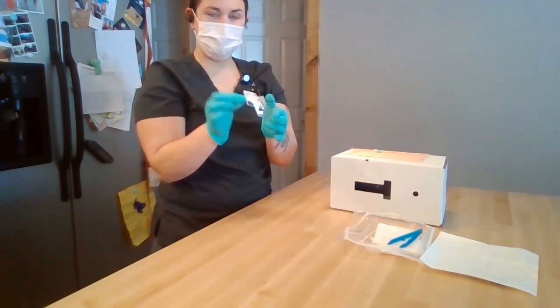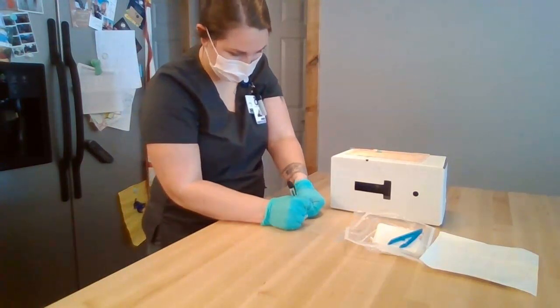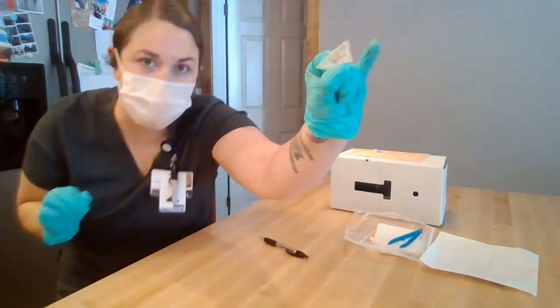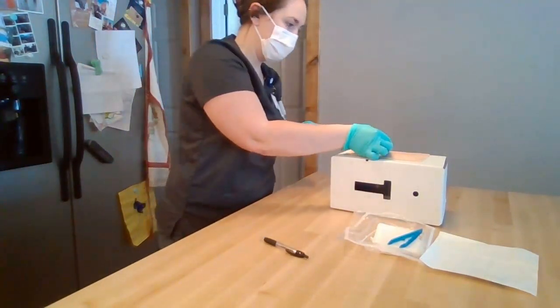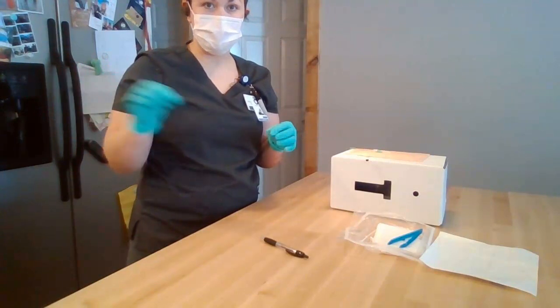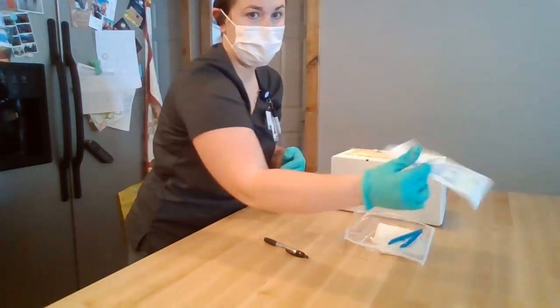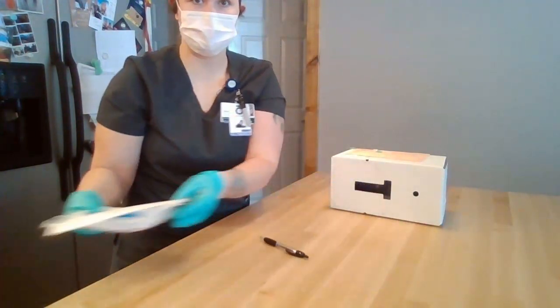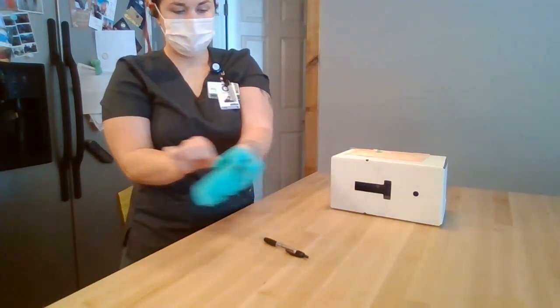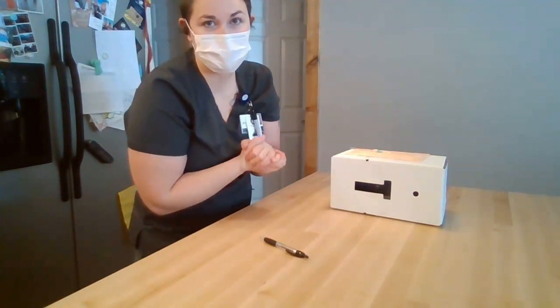Then I'm going to take the name strip and write my name, the date, my initials, and the time. Now that I've written on it, I'm going to place that on my dressing. Once I've labeled my dressing with the date, the time, and my initials, I can discard the soiled supplies, remove my soiled gloves, perform hand hygiene, and document that the sterile central line dressing change has been completed.